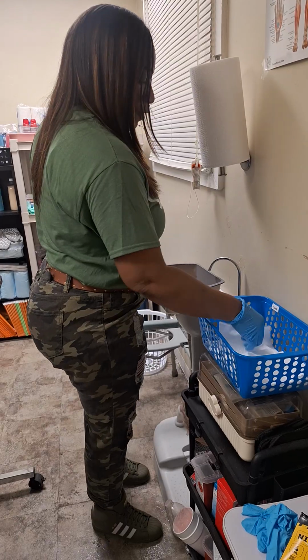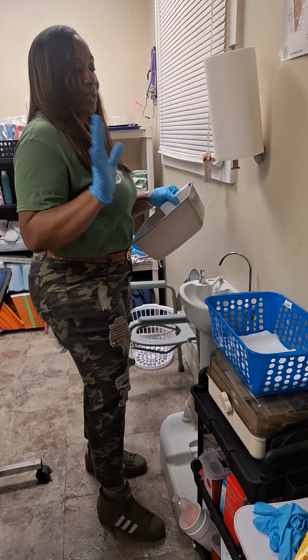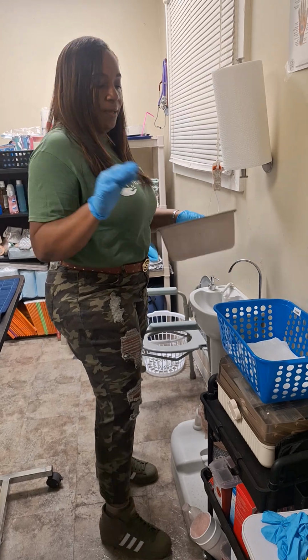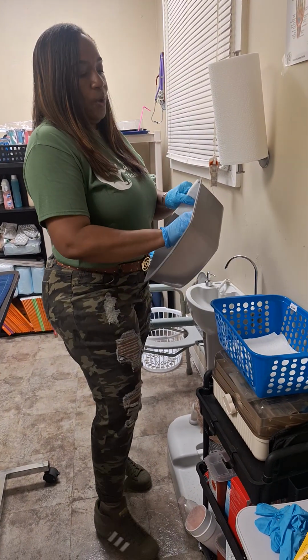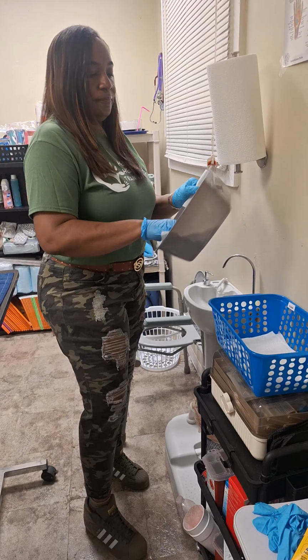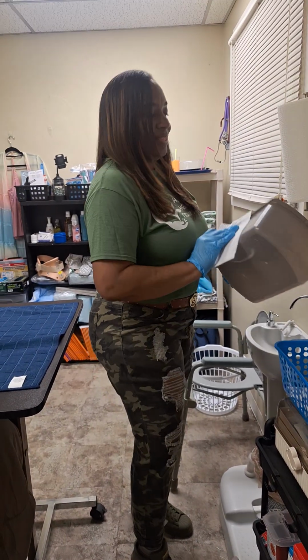I'm going to grab a fresh piece of paper towel to hold it, because my gloves are contaminated, so I don't want to touch that. So I'm going to take another piece of paper towel. I'm going to clean the inside. I'm going to discard that. I'm going to dry the outside.